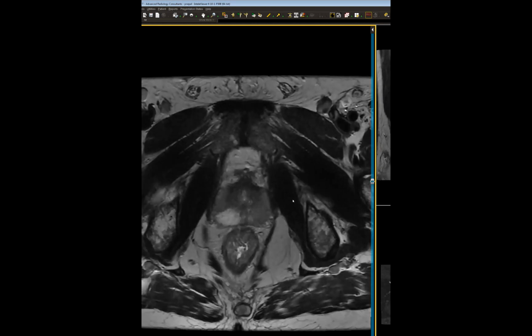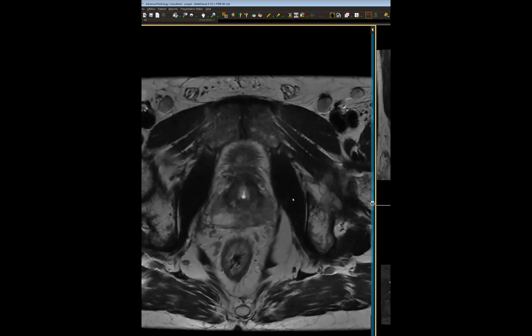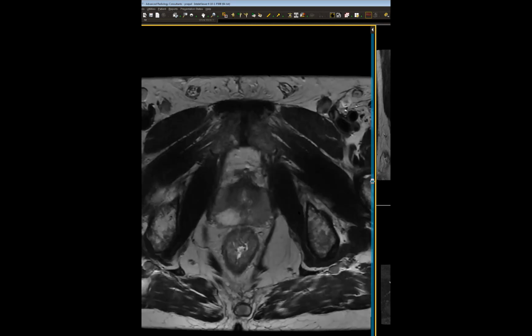I know Steve's on. He's our prostate expert. A thought would be prostatitis potentially. Yeah, that's a good thought, because this was more involving. As a resident, I was thinking whether that spared region is actually an infarct, but I totally messed up with the ADC and diffusion.